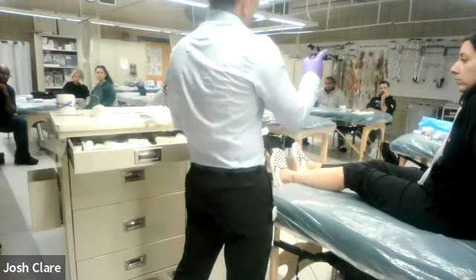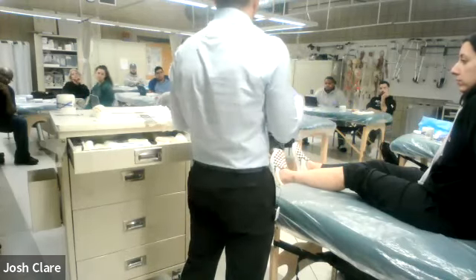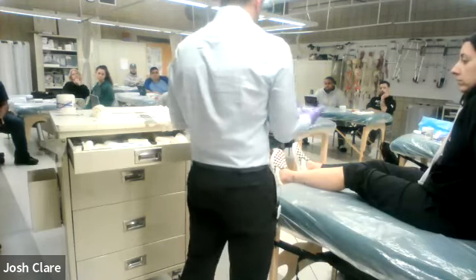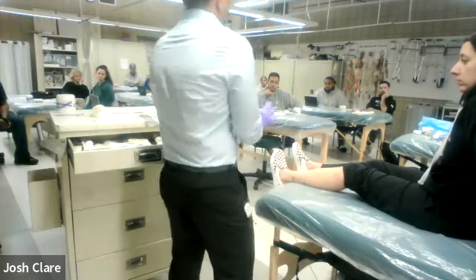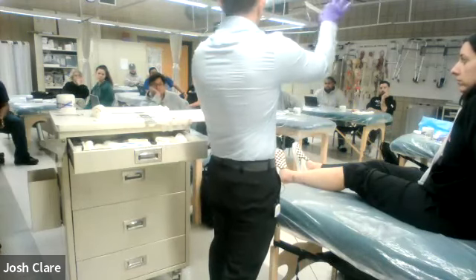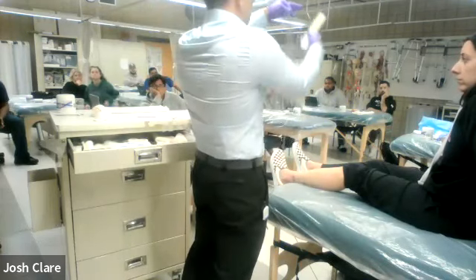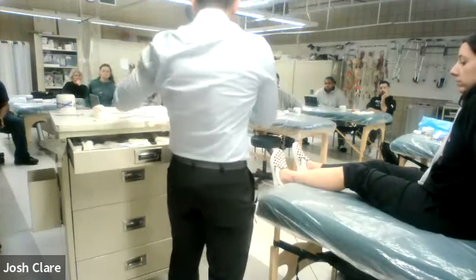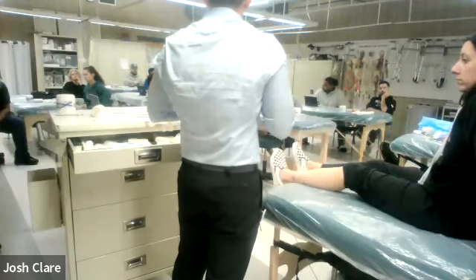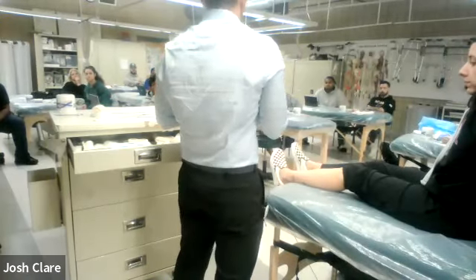Now my gloves are soiled — the wound is exposed. What I would do is remove these gloves and start measuring, as long as I can be non-contact with the patient. If I need to be in contact with the patient, what should I do first? Wash your hands — absolutely. And now I need to actually do the sterile field and sterile process. So I'm going to take the measuring device — goniometers on the sides have rulers too, so we can use a goniometer.